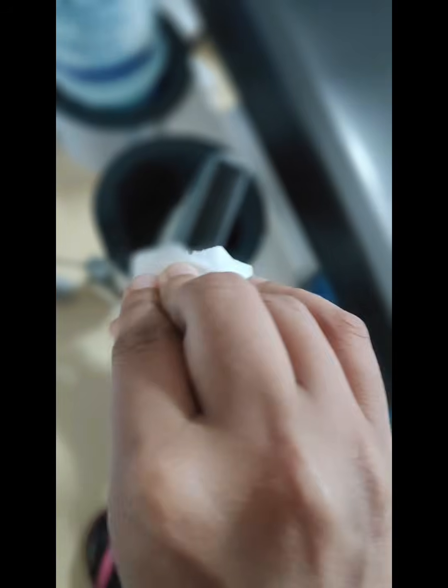Last, make sure to wipe your probe and wipe your patient. I hope this video provided some insight regarding head-to-toe bedside ultrasound examination, which is very essential in all critical care setups. Thank you.